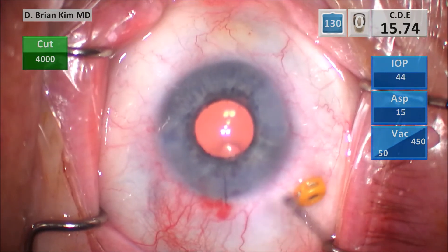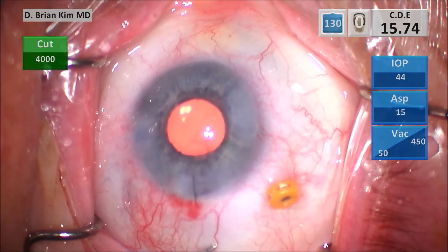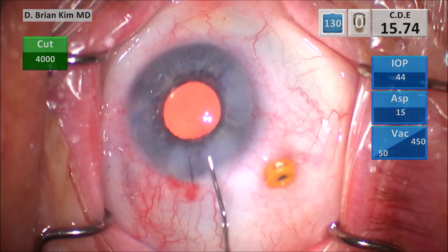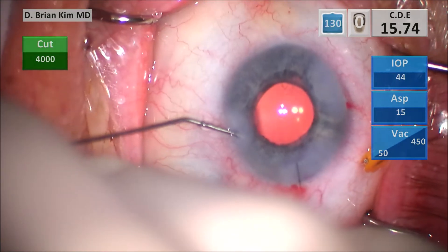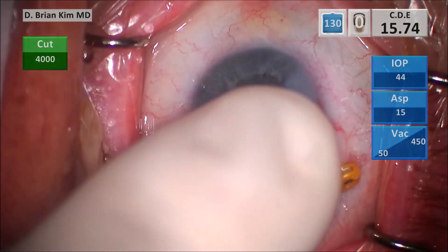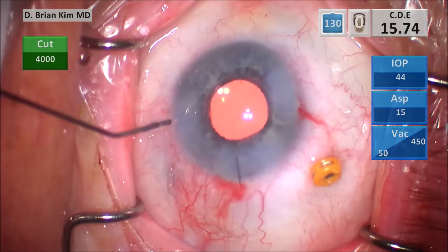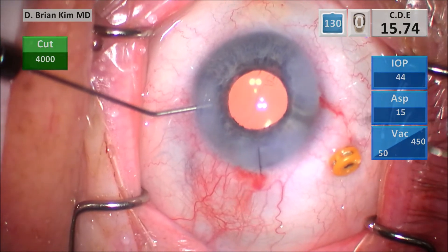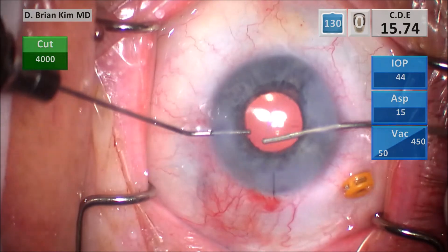As I take the cannula out, I'm manually pushing BSS with the cannula and quickly hydrating my incisions. I switch hands and push BSS with the cannula, and as I'm doing that I check with the Lester hook — a final check to make sure I'm maintaining the optic capture configuration and that my incisions are 100% sealed.